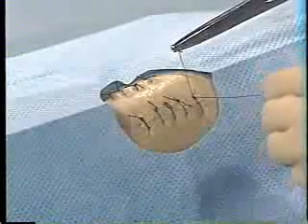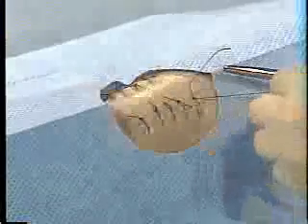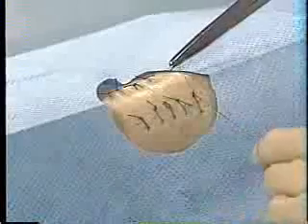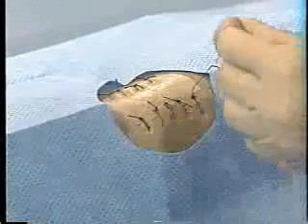Here's the V, instrument in the V, wrap the long end toward the short end, grab the short end, pull it to the other side. Instrument in the V, wrap the long end toward the short end, grab the short end, and pull it to the other side. Notice that your hands will cross and uncross as you perform these square knots.